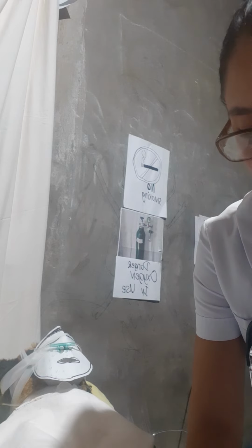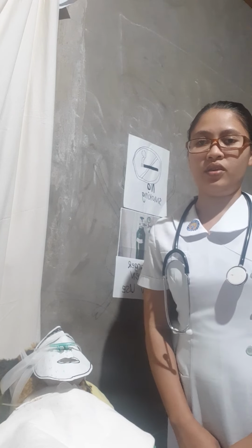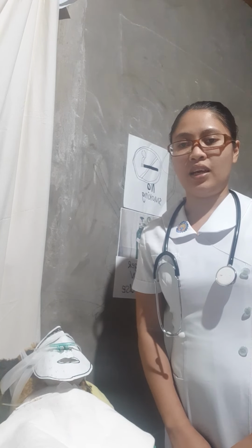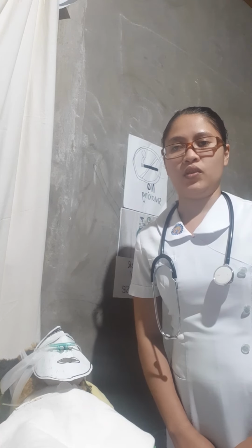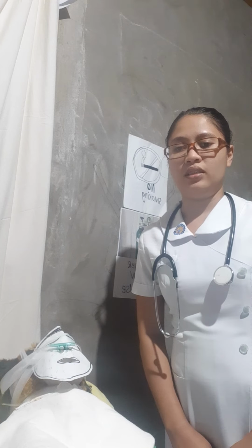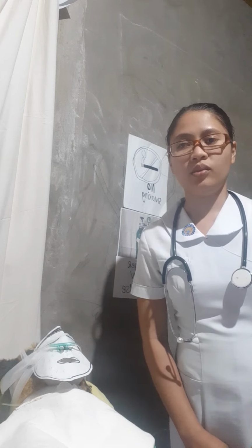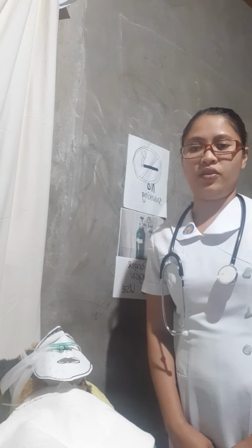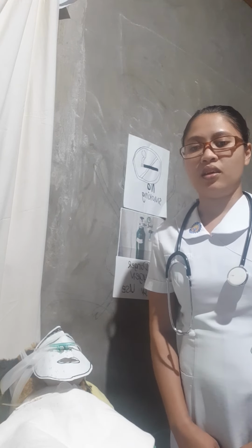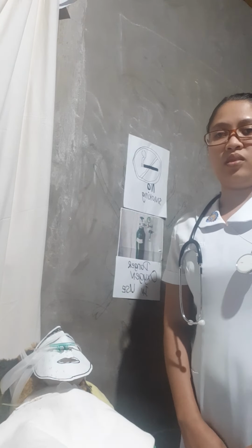Next, we need to adjust the suction to the appropriate pressure. For the wall unit, for adult patients, 100 to 150 mmHg, neonate 60 to 80, infant 80 to 100, and children 100 to 120 mmHg. Then for the portable unit, for adult, 10 to 15 cmHg, neonate 6 to 8, infant 8 to 10, and for children 10 to 12 cmHg.